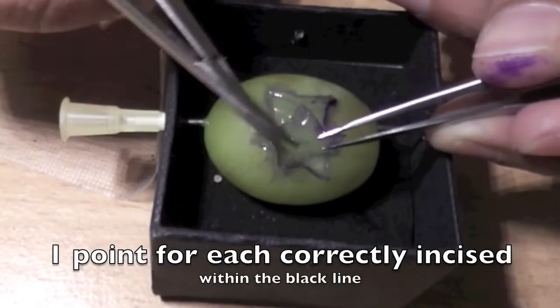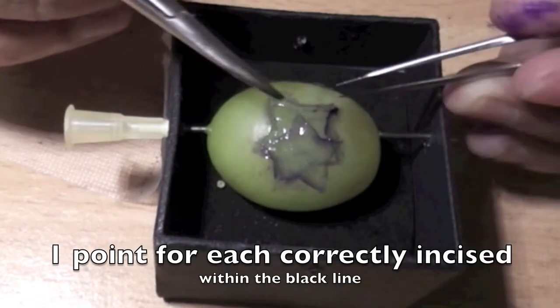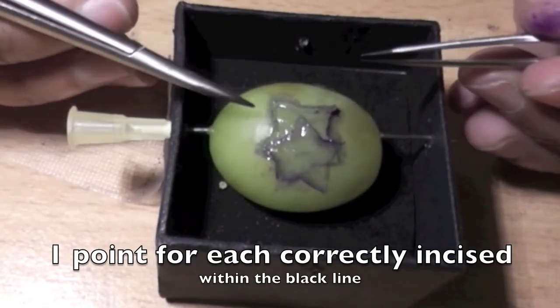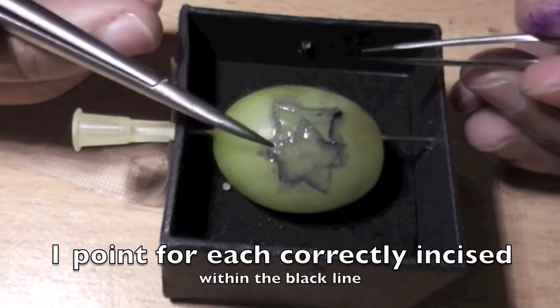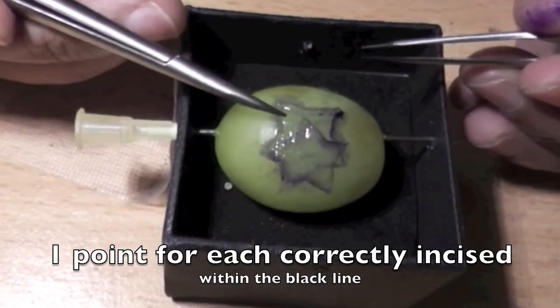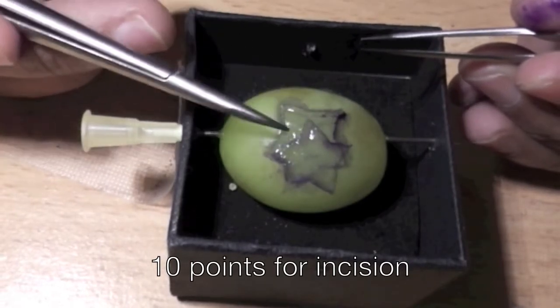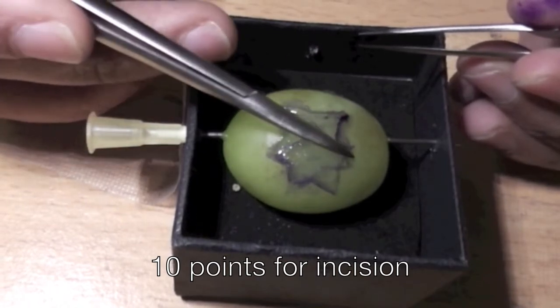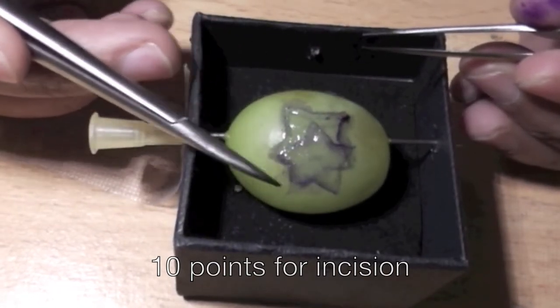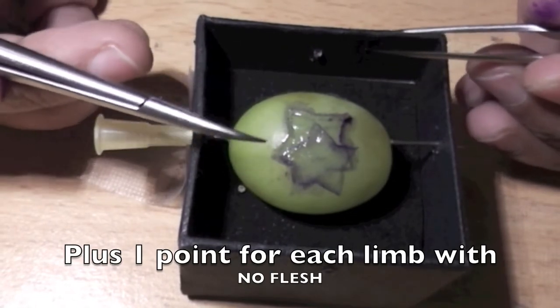Okay, so in terms of scoring, I've incised exactly between the black line. There's some black here and some black remaining on the grape. I'll give myself one point for every edge that I've incised. So that's one, two, three, four, five, six, seven, eight, nine, ten. So that's ten points so far.